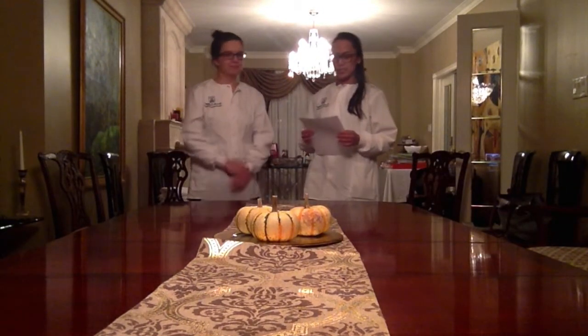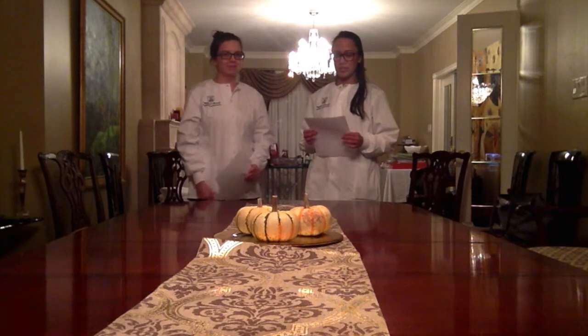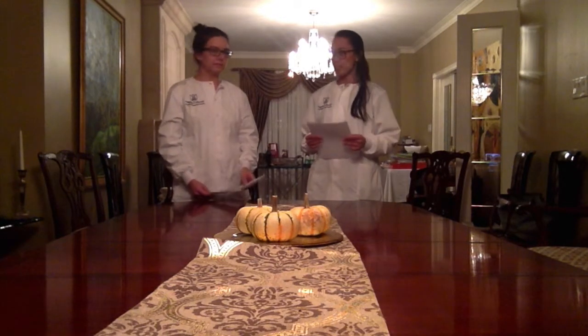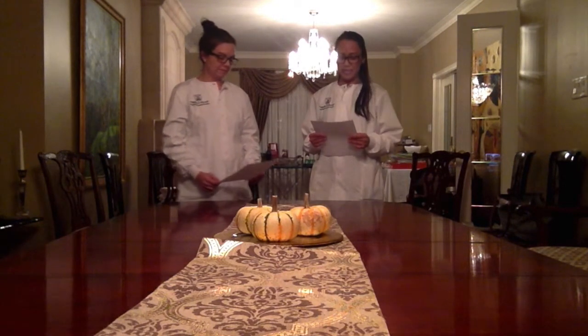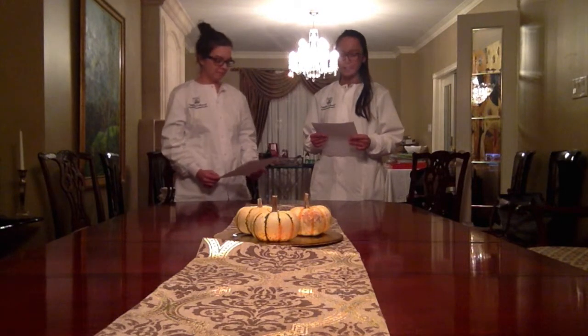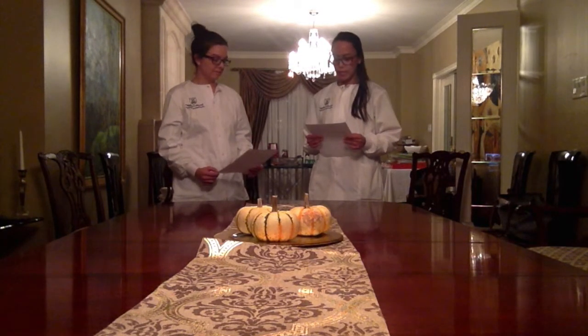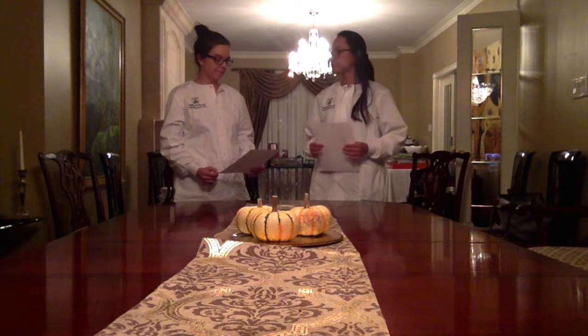Amanda and I will be discussing patient comfort when taking extraoral radiographs and intraoral radiographs. Extraoral radiography is better than intraoral radiography. It is more comfortable for the client to take extraoral radiographs because the client is only required to stand still for about 30 seconds and bite on a bite stick in the case of a panoramic radiograph.